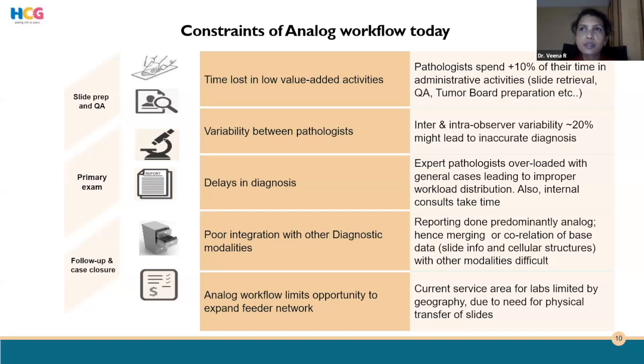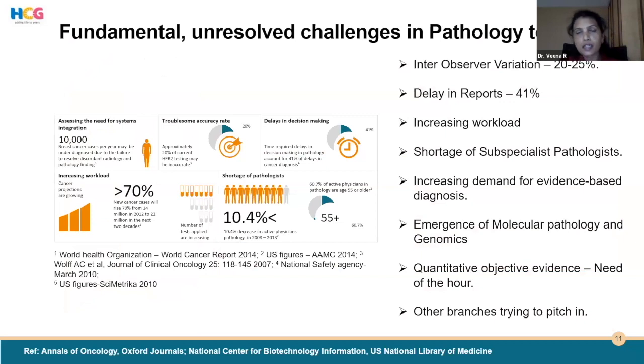So if we continue to use the microscope, we continue to be away from all these latest technologies, which ultimately are going to have an impact on the patient's management. These are some of the limitations if you continue with manual microscopy. But I don't say that by continuing with manual microscopy we are compromising on the patient's report. In the current era, though, it's always better to adopt the latest technologies, and we know that we do have certain challenges in pathology which need to be addressed.